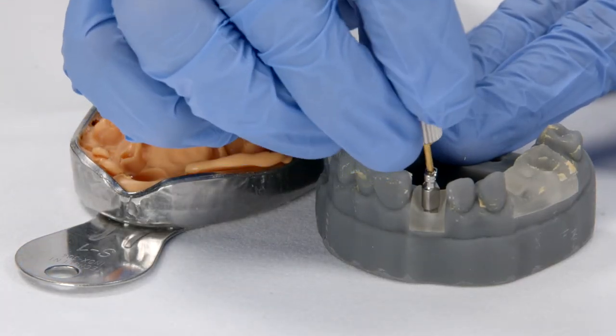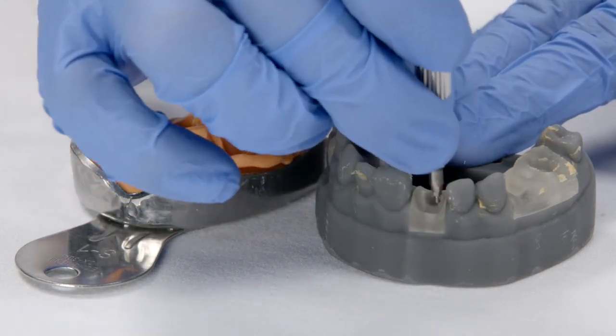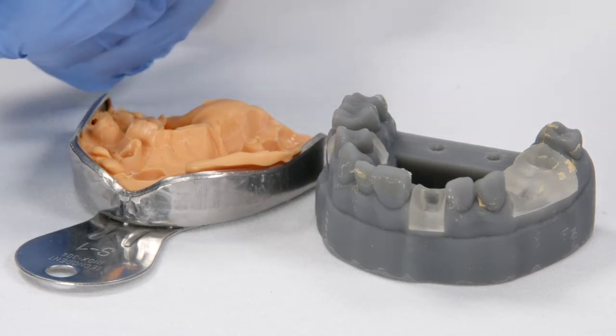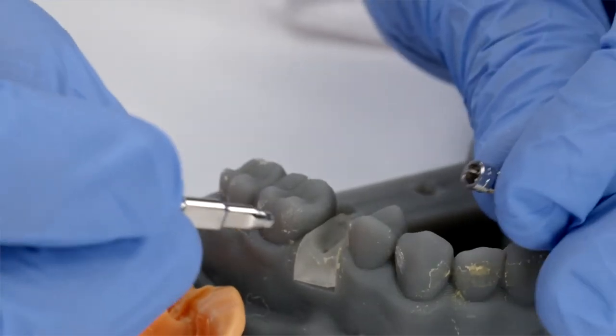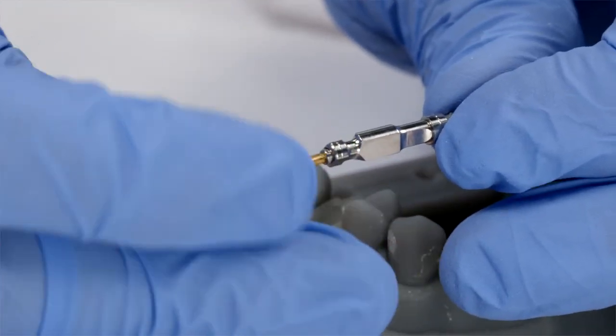Next, take the impression coping out. Unscrew the impression coping. Making sure they are engaged, connect the implant analog and screw all the way down.